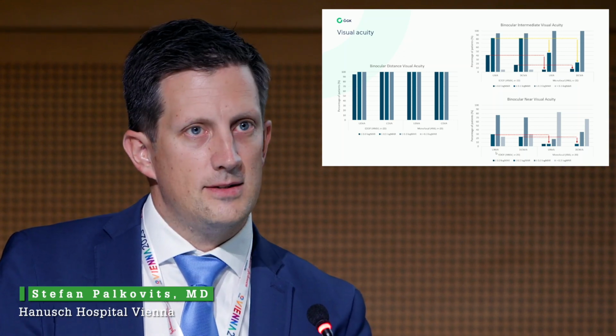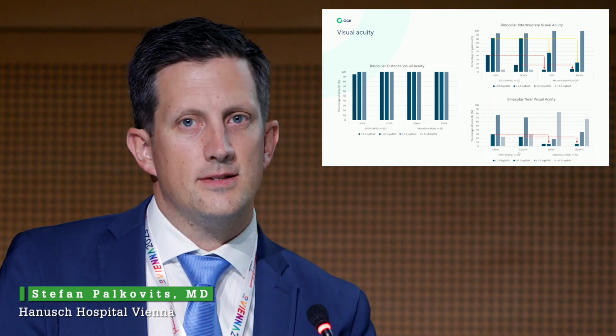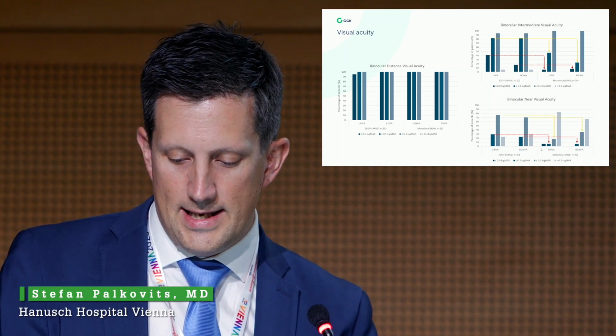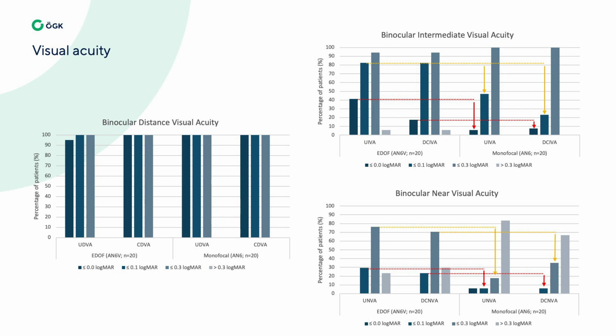A similar thing I can show you for the near vision. We have the uncorrected near visual acuity and the distance corrected near visual acuity, and we see these values were again higher in the EDOF group as compared to the monofocal group.